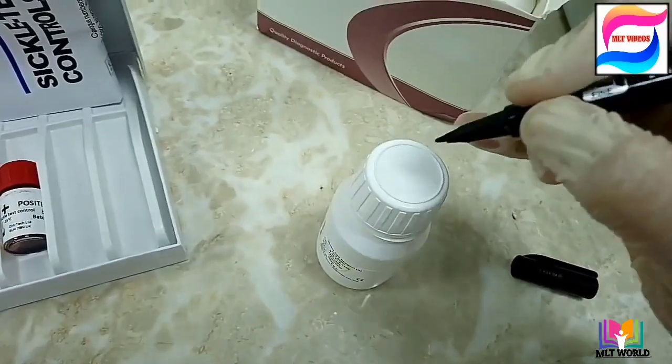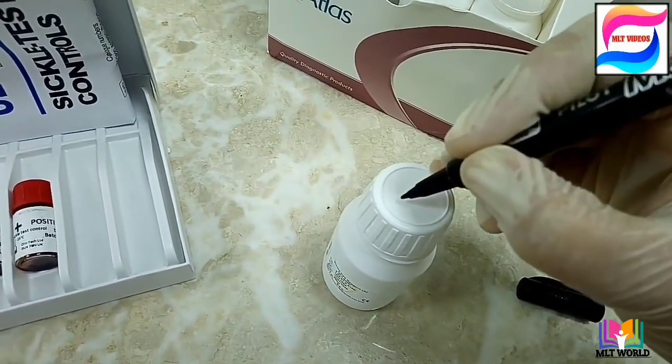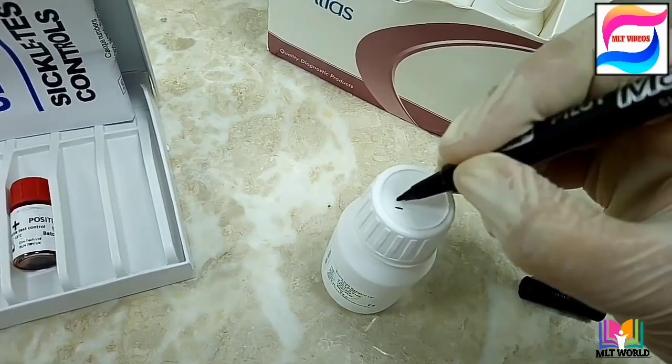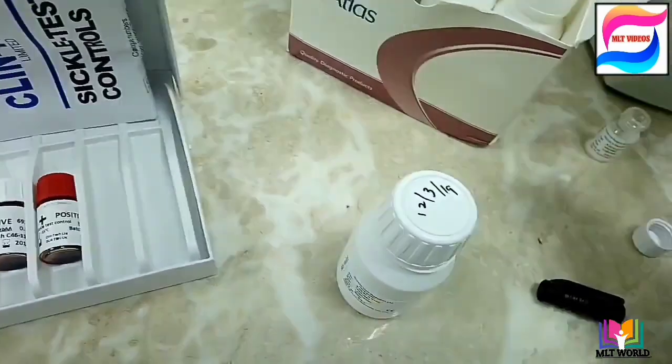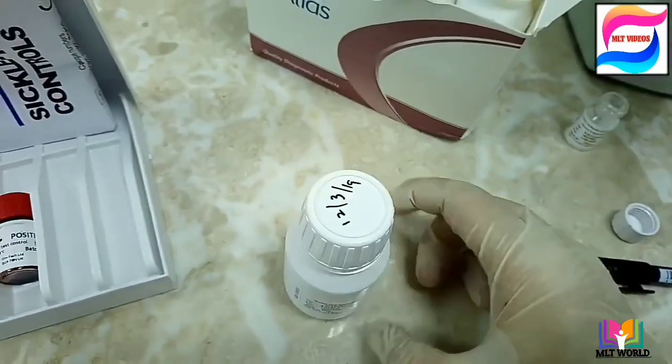Write the date after making the reagent so that you know when the 15 days are up and when to discard it. If the reagent is finished before 15 days, that is fine.